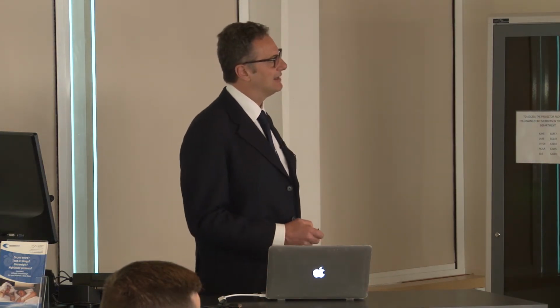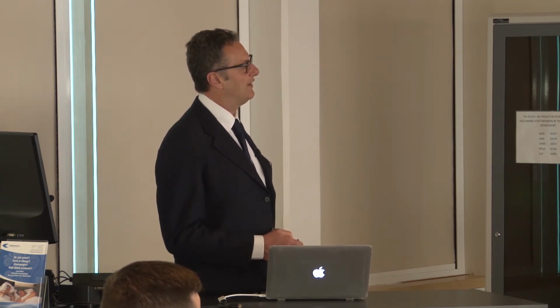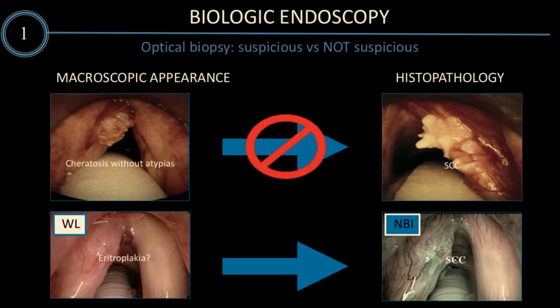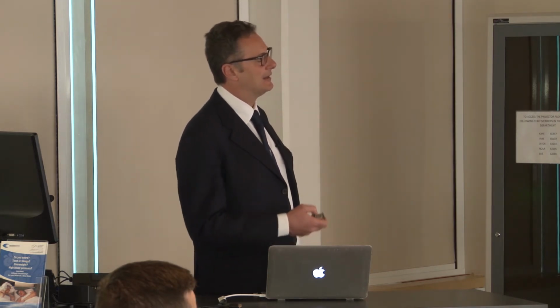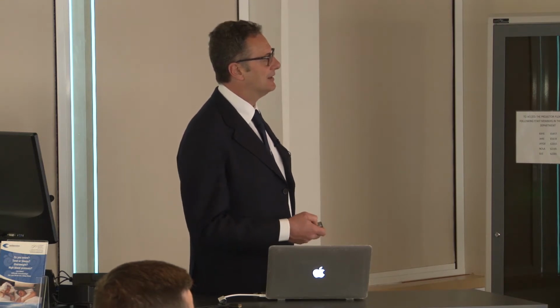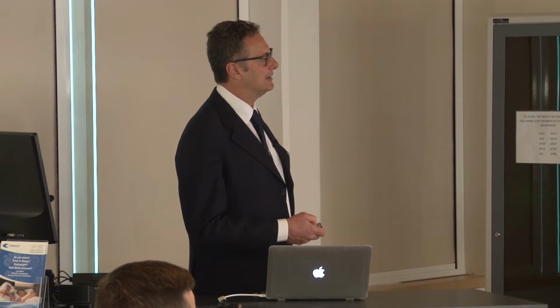So talking about the larynx, usually we face some lesions like leukoplakia. With the standard endoscopy, you cannot presume the histology because the appearance is very similar, even if the histology is completely different. By contrast, in the erythroplakia, you can appreciate with NBI the atypical dark spot inside the lesion, and also the vessel that changes direction inside the lesion. So with NBI you can see better, and also you can define better the limits of the lesion compared to the standard endoscopy.